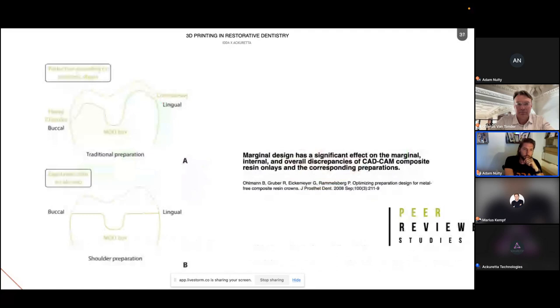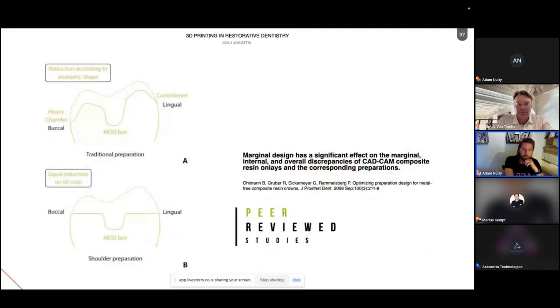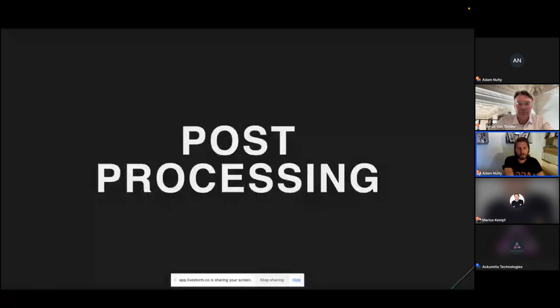And this really is just to emphasize that point, that the marginal design means that we can keep a lot more of the original tooth structure without having to trim it down just for a level of thickness, if we round everything off, where everything is distributed in terms of the forces within that tooth. So let's finish up with talking about the post-processing queue.